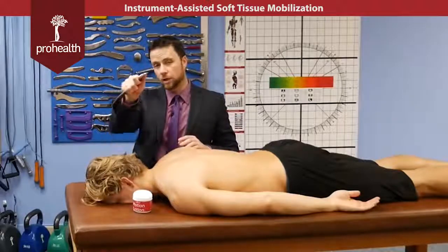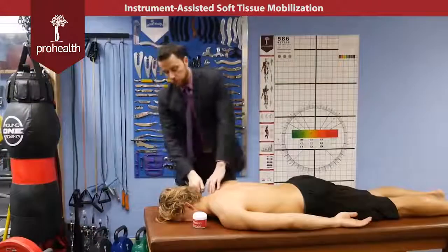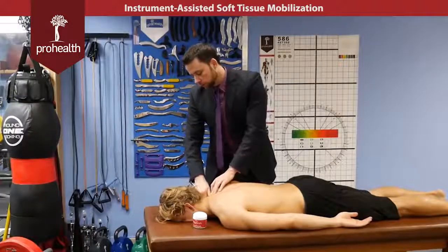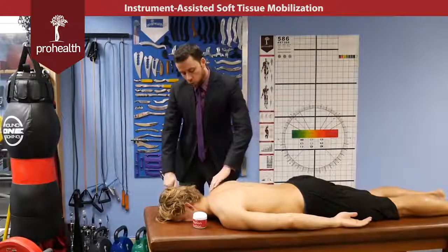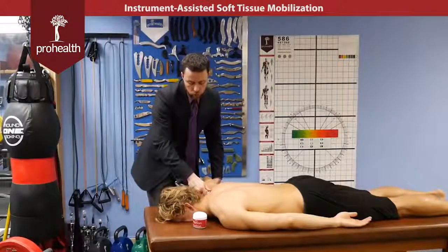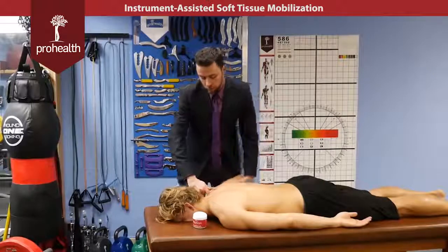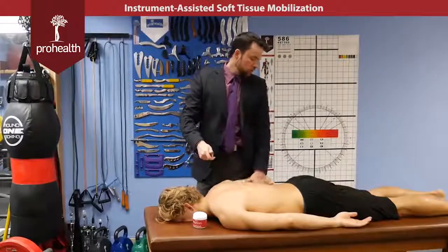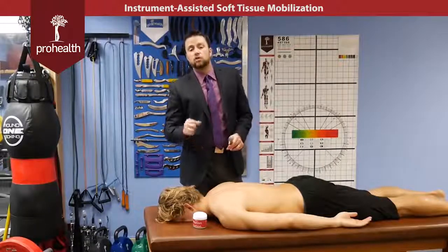And if I wanted to get even more specific than that, I can use this instrument like it's my extra thumb, where I can push into it and I have a grip through my entire hand, and we could separate through the different tissues and start to sink in and just really work your way through it. Or maybe even doing it with a little bit of pinning and stretching, or if you were doing maybe more of a supraspinatus type issue, you could take the arm up like this a little bit, shorten supraspinatus, hook in, and then take him through a little bit of a lengthening action. Shorten, lengthening action. Taking that contact pressure off of your thumb and onto a very specific edge gives you specific treatment.